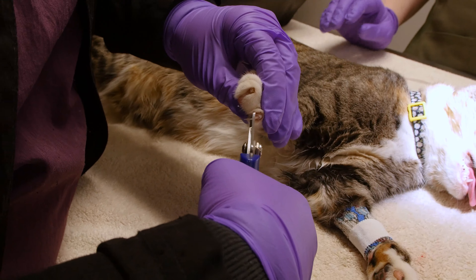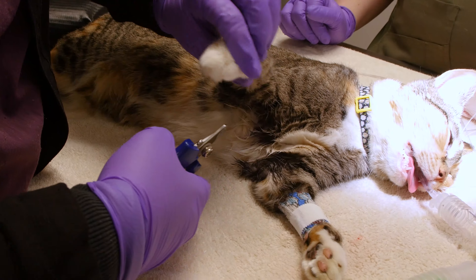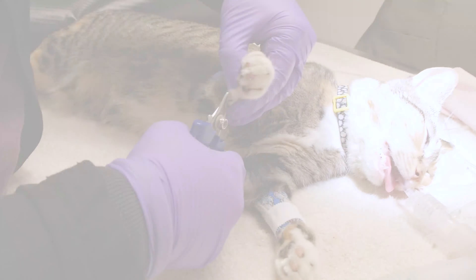After the dental procedure, we will remove the endotracheal tube once the patient is regaining their ability to swallow, among other reflexes. In the recovery phase, we trim your pet's nails and continue to monitor by checking vitals like pulse, temperature, and respiration. Your pet will continue to be monitored until he or she goes home with you.